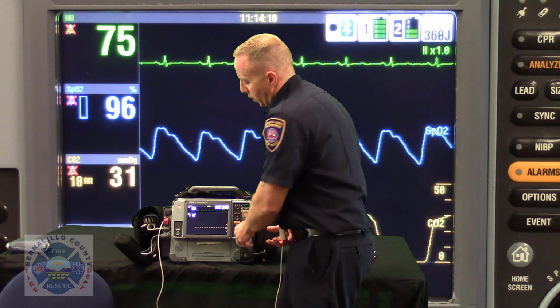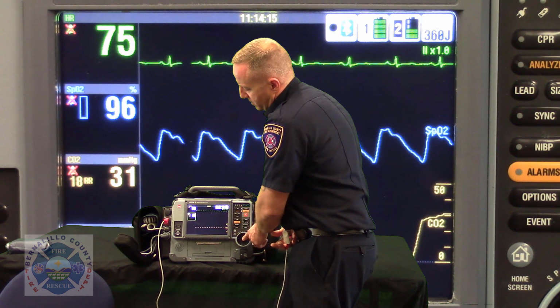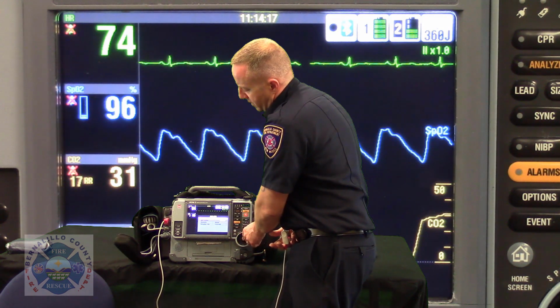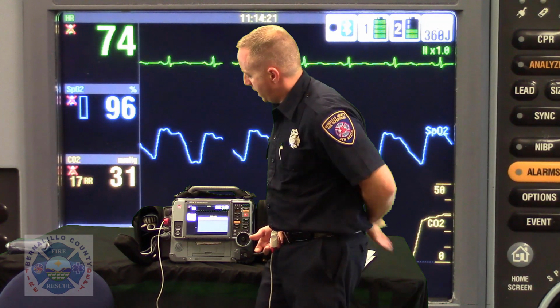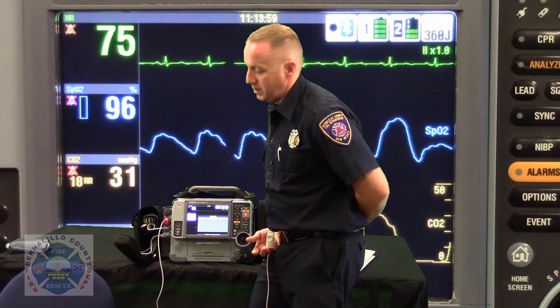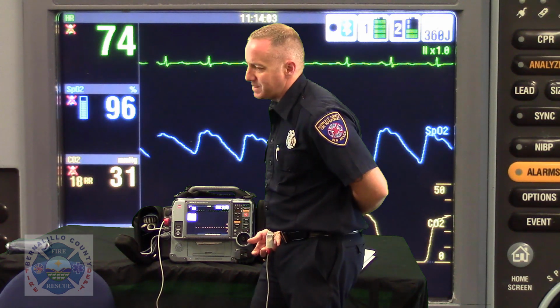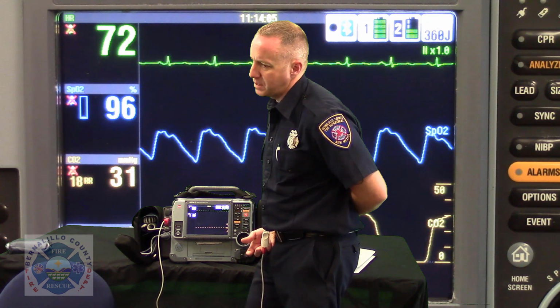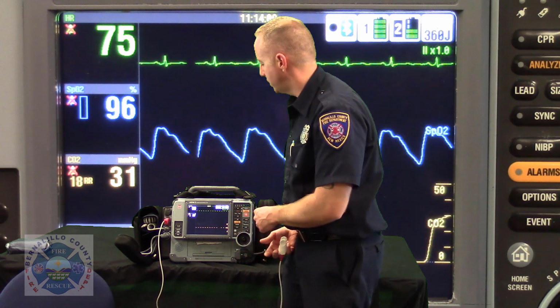Now, I want to go over and look just to make sure that I'm not missing something. So I'll scroll my selector dial over to pulse ox, parameter, and down to SpCO. And you can see that I currently have an SpCO reading of 0%. Now, I don't need to change it back because the monitor is going to go about 10 seconds and it's going to say, yeah, not significant, you'd rather watch the patient's SpCO, or SpO2, excuse me.